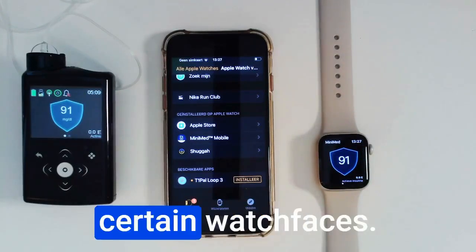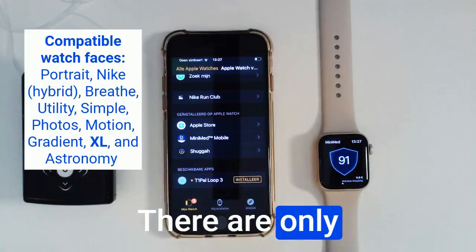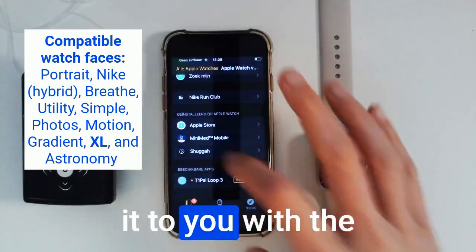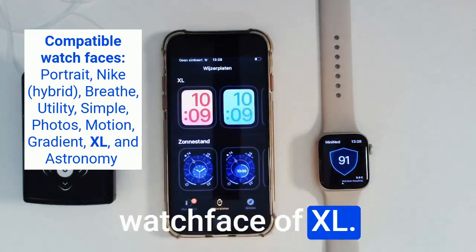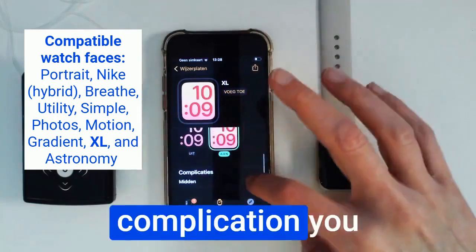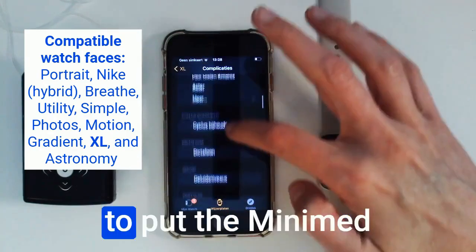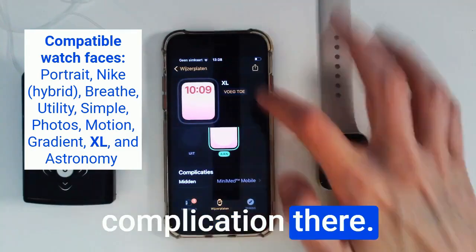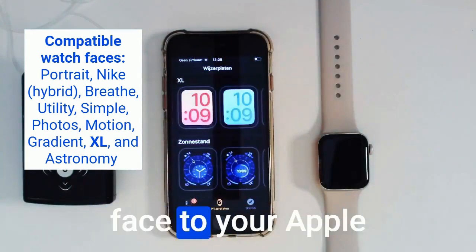There are only certain watch faces that are compatible, and I will show it to you with the XL watch face. Here you can see that in the complication you will have the choice to put the MiniMed Mobile app as a complication.